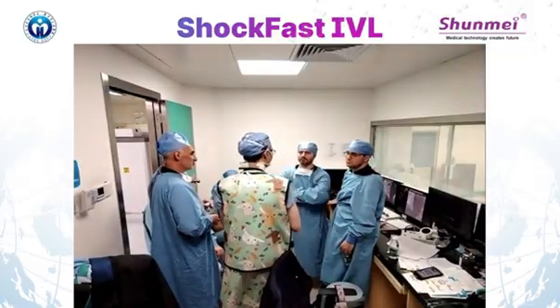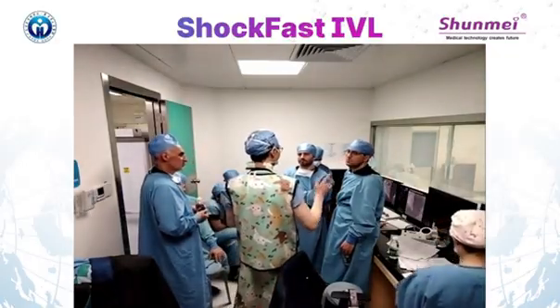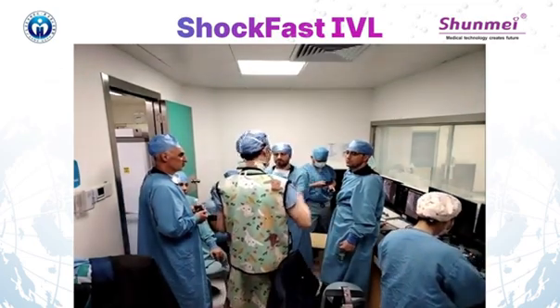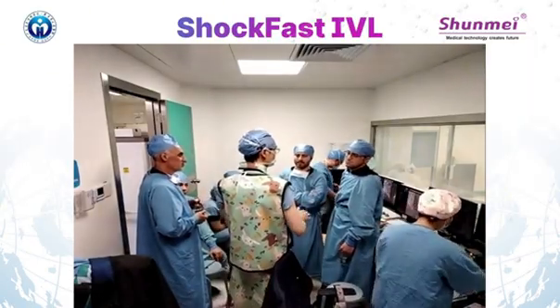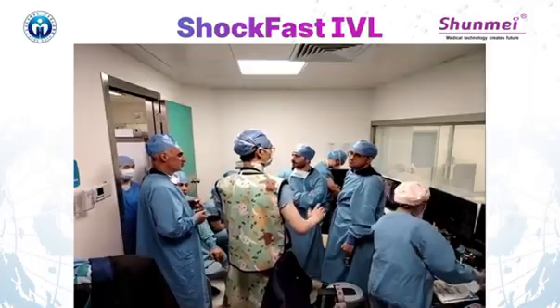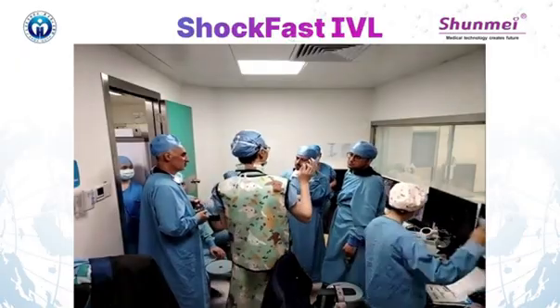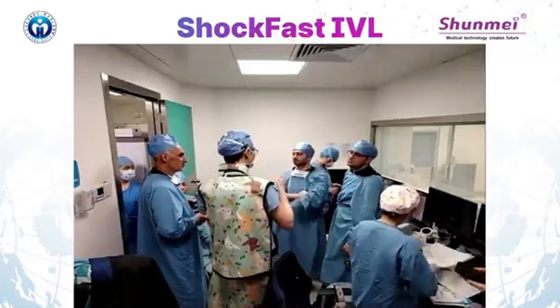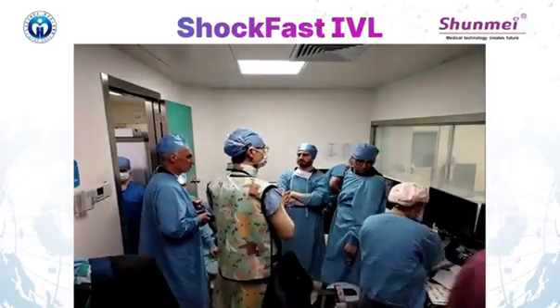So it's quite difficult for the IVL balloon to cross. Even the regular non-compliant balloon, the used one, could not cross. So I used a brand new non-compliant balloon to pre-dilate up to 12 or so atmospheres, open up some space, and then used the Godzilla to deliver.